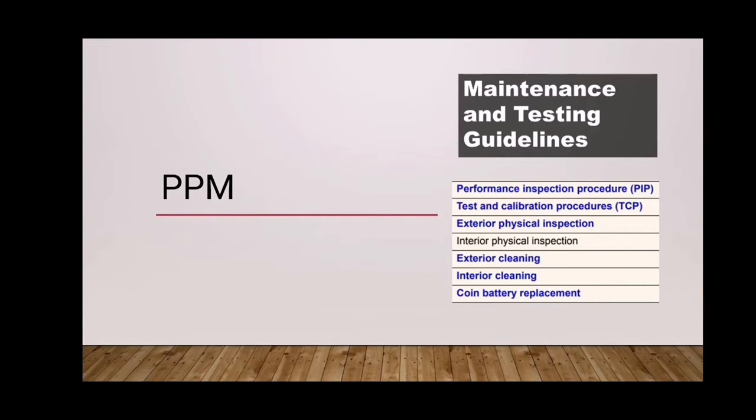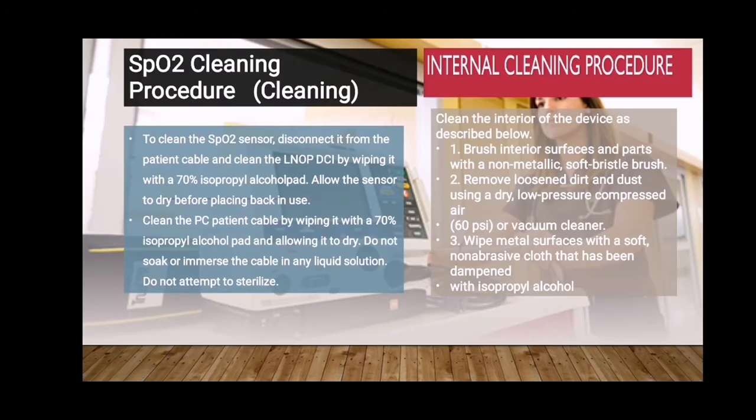This is the maintenance and testing guideline. Performance inspection procedure, PIP, testing and calibration procedure, TCP, exterior and interior physical inspection, exterior and interior cleaning, battery replacement.